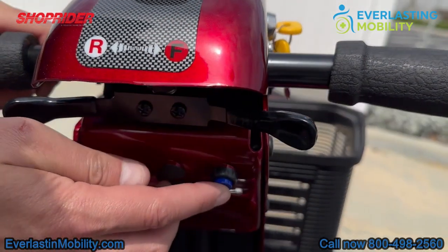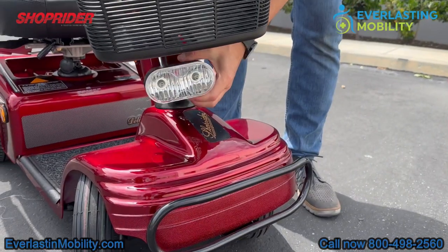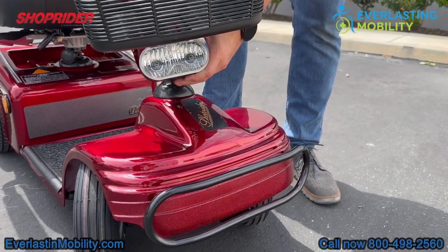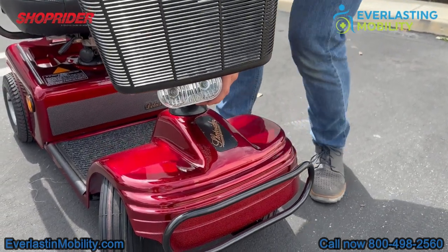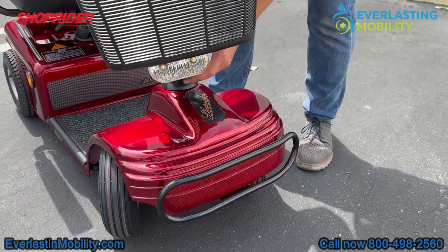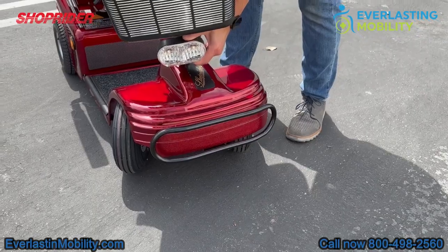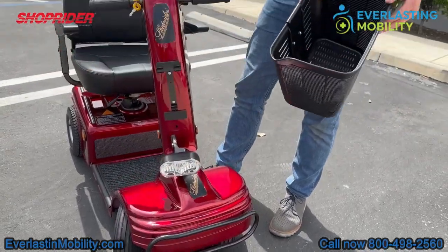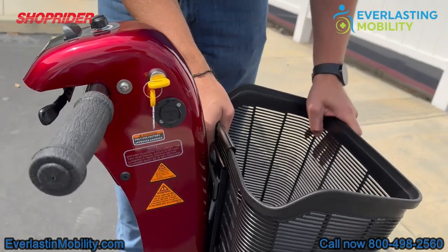This blue button is the front headlight and the yellow button is the horn. The headlight is adjustable up and down, and when turned on, it's a pretty bright light that illuminates the path in front of you — though it's hard to see in daylight. The front basket is also removable, it's large and has a lot of storage space, which is a nice convenient feature.